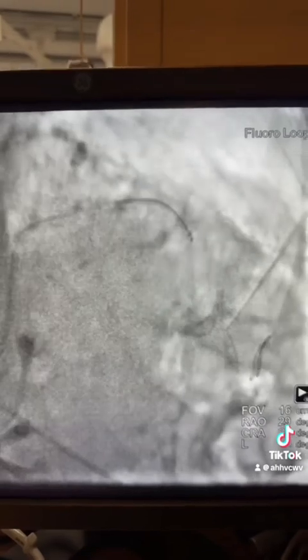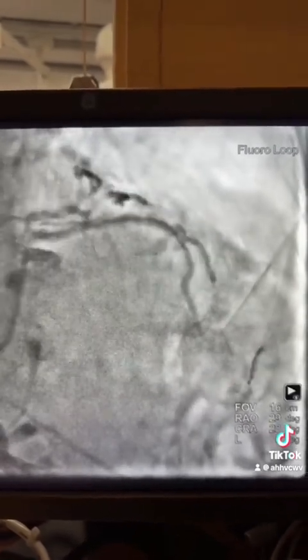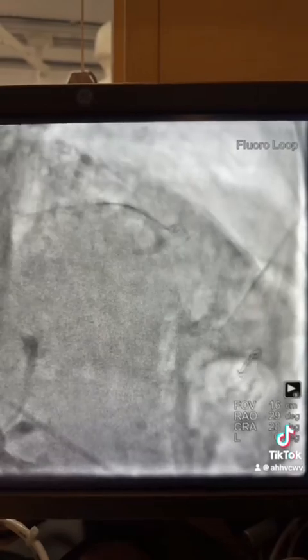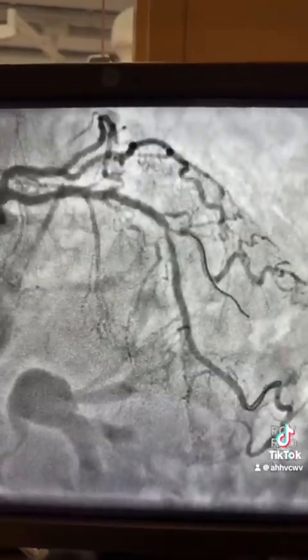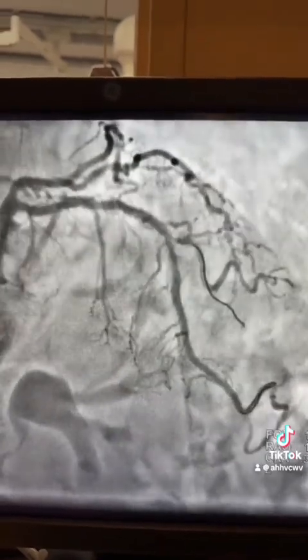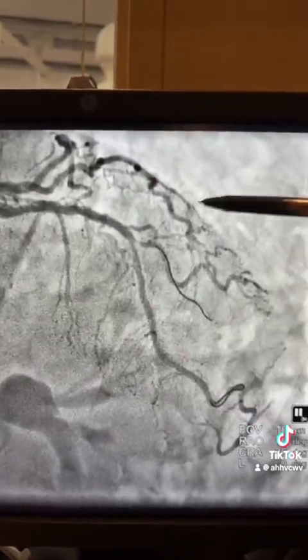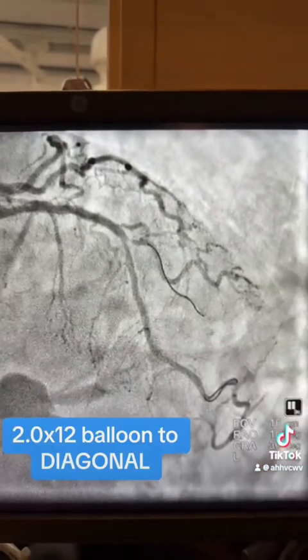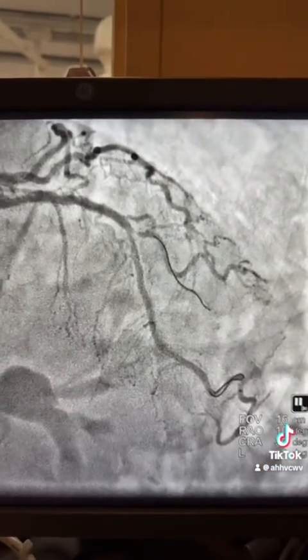Once you have the main wire in the distal LAD segment, pass the other wire — the one in the circumflex — directed toward the diagonal. Now we can take a final picture before starting the intervention. Here on the angiogram two wires are in place. This is the target, so I have to use a 2.0 balloon first, and then upgrade it to shockwave 2.5.